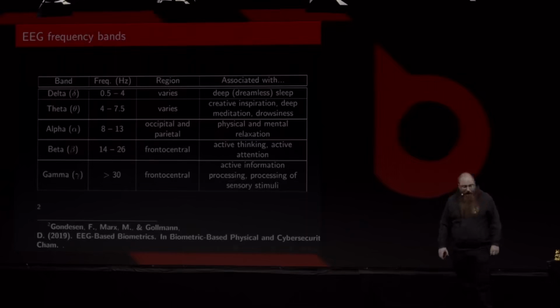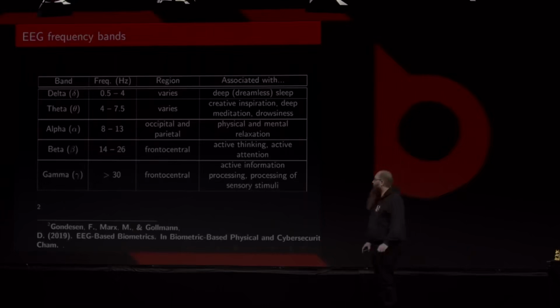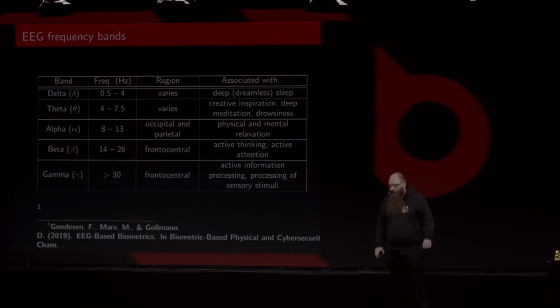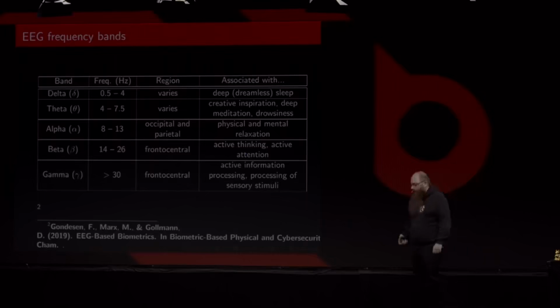Important is the alpha band. That's something that should be in the plot that I showed before as well. We couldn't really see that in the timeline. If I had instructed the subject to have the eyes closed but not open, we would have seen oscillations in that range on the electrodes that are above the visual cortex, because they would go to idle state if nothing is seen, and we would have more power in there.